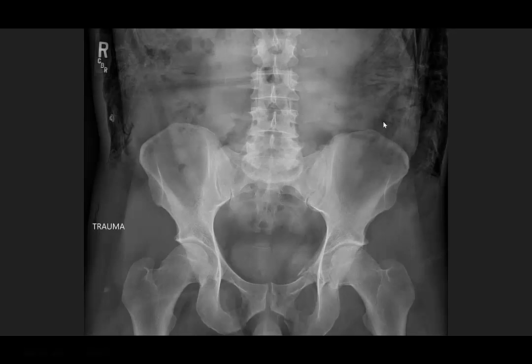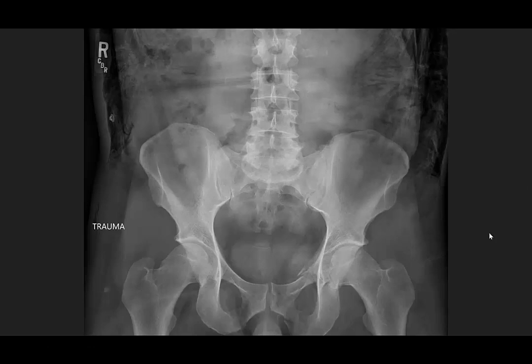Just for bonus, he's got multiple transverse process fractures here, here, and here as well. So that's it — those are our three cases, showing some different pelvic fractures.